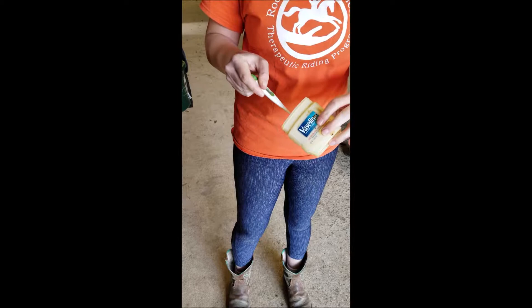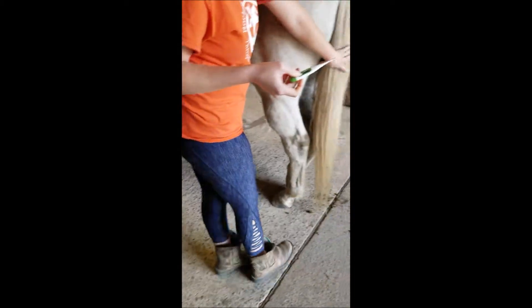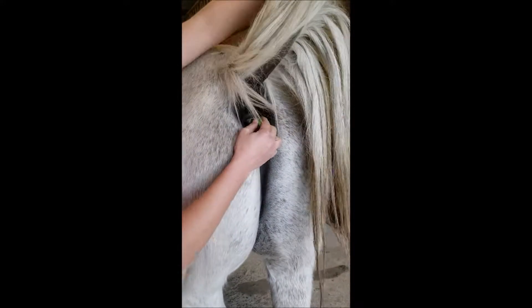The most accurate way to take a horse's temperature is rectally under the tail. Apply a lubricant to the end of a thermometer and insert it gently into the horse's rectum, being careful not to stand directly behind the horse but off to the side, in case he decides to kick.